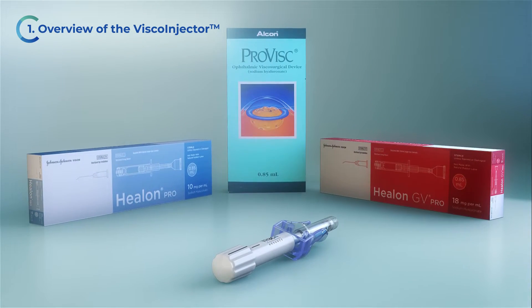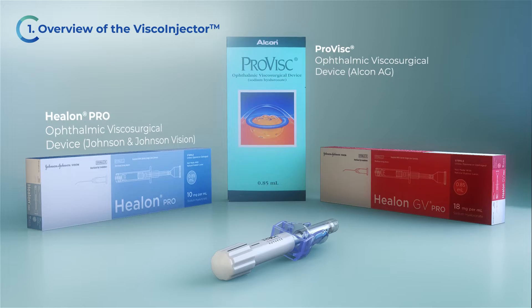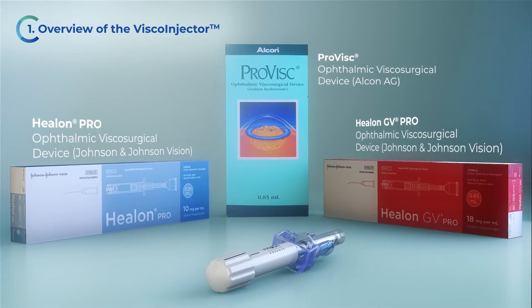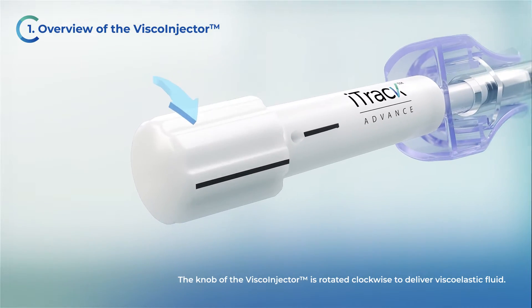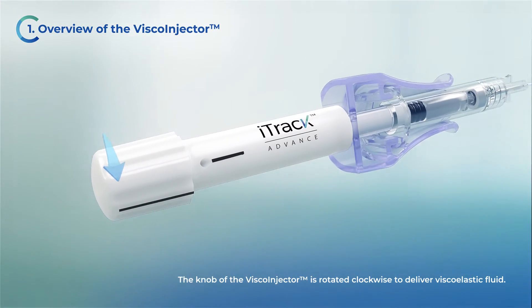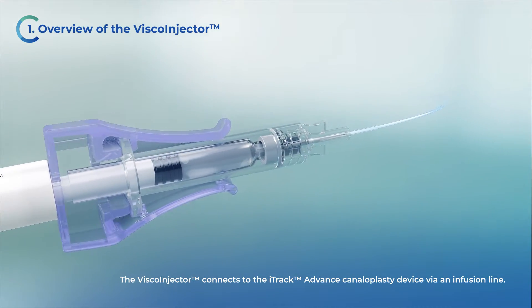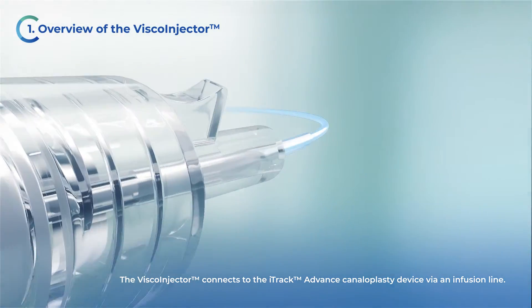The viscoinjector can be used with the ProVisc, Helon Pro, and Helon GV Pro. The knob of the viscoinjector is rotated clockwise to deliver viscoelastic fluid. The viscoinjector connects to the iTruck Advanced Canaloplasty device via an infusion line.